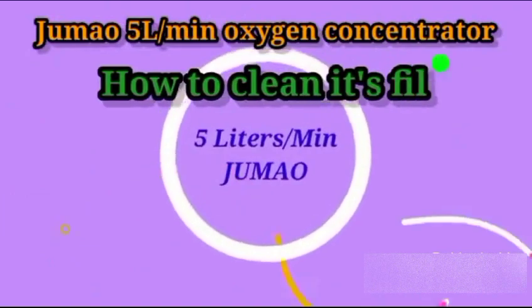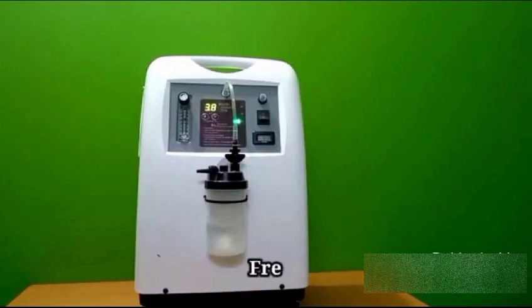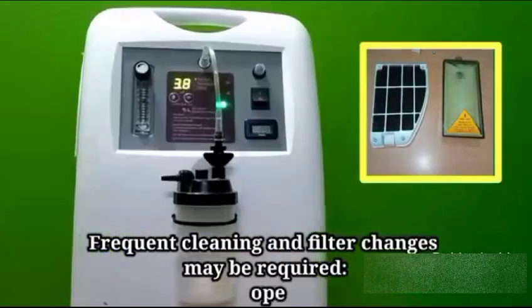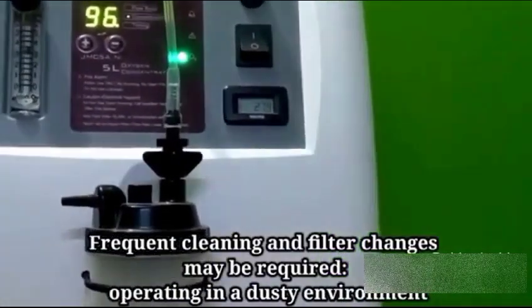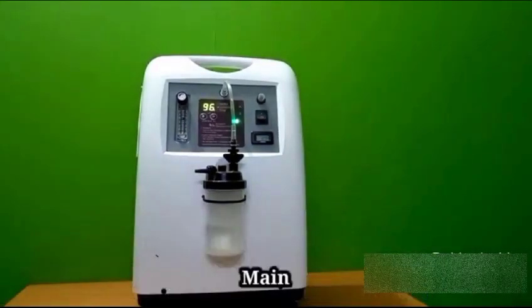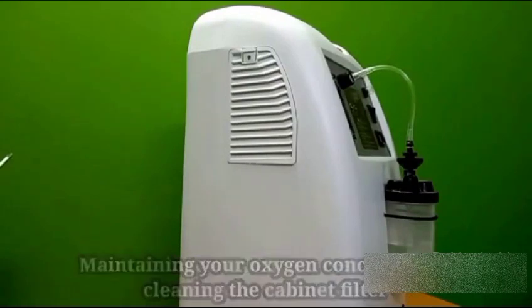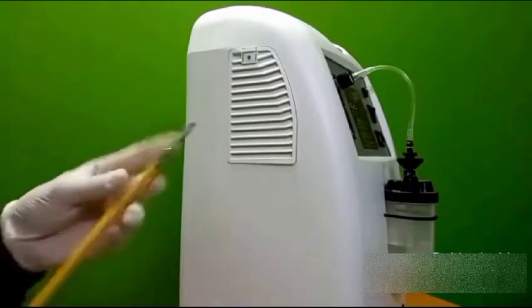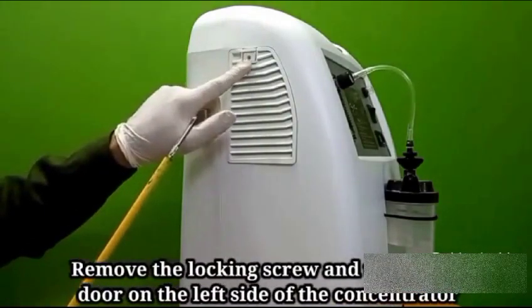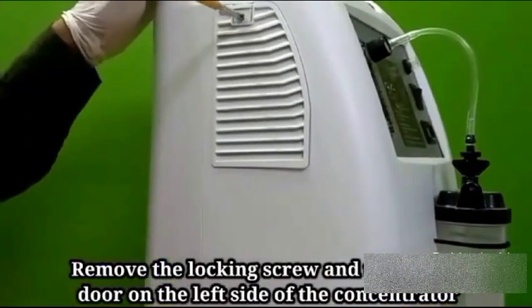Today we will see how we will clean the filter of the Oxygen Concentrator. Here you can see there are two filters. On the left hand side of the concentrator, on the outside, you'll find a cabinet. In that cabinet there will be a screw that you have to unscrew. You can see it in the video.